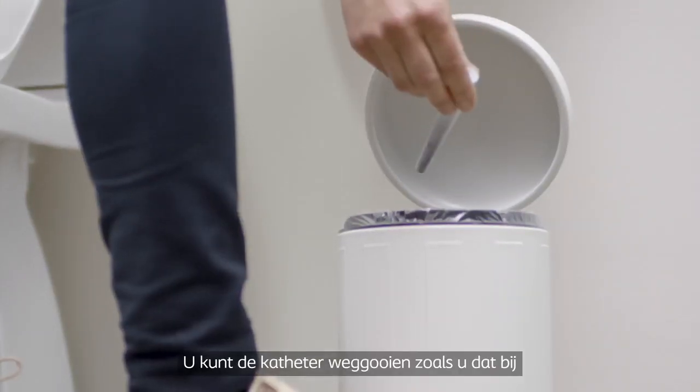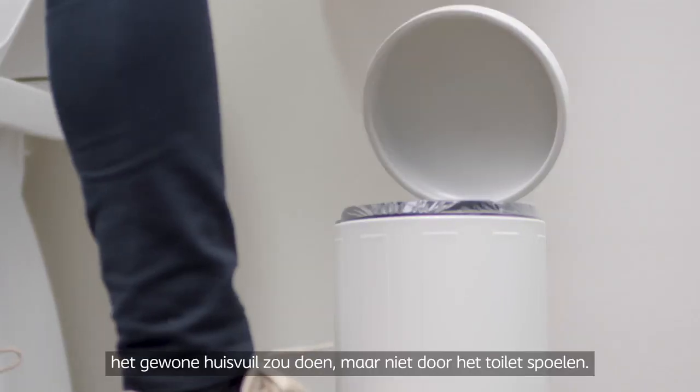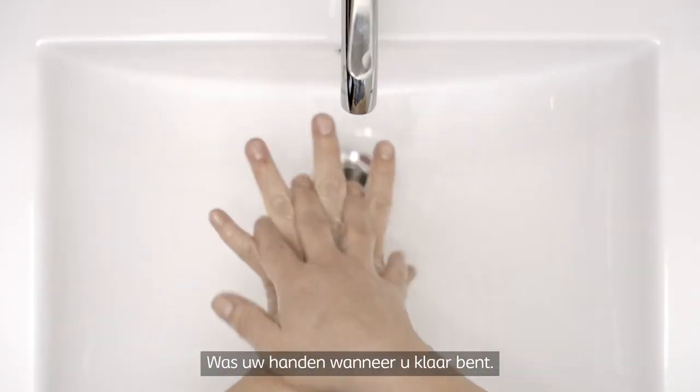You can dispose of the catheter as you would with normal household waste, but not down the toilet. The container is recyclable and can be disposed of according to local guidelines for recyclable waste. Wash your hands and you have completed the process.